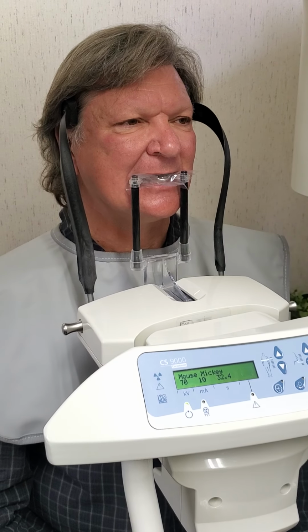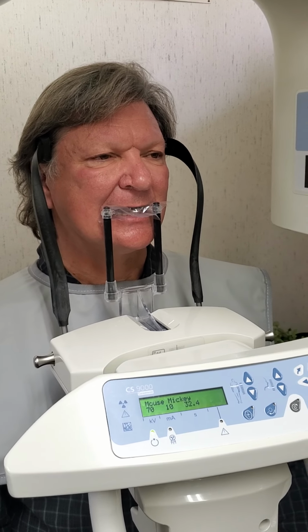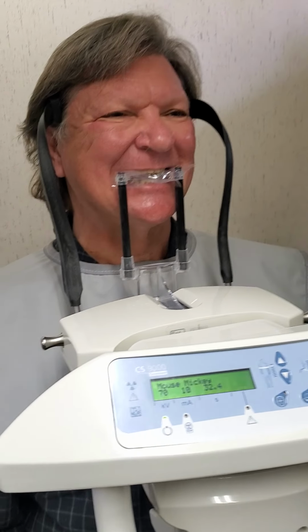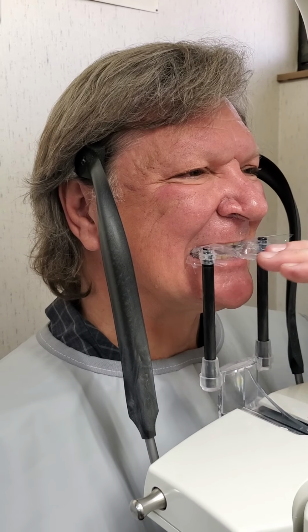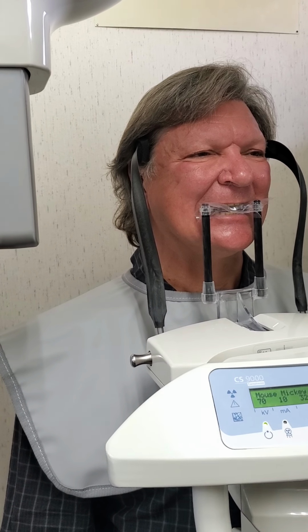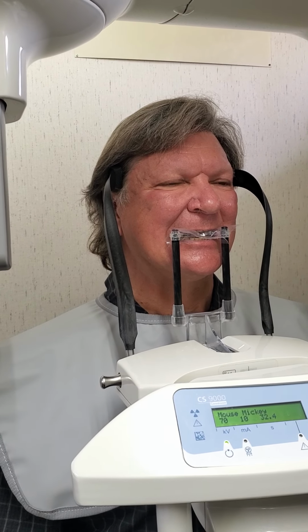So now, while they're biting on there, have your patient smile as wide as they can so we can see teeth. Go ahead and smile. Now you can see the occlusal plane of those top teeth is parallel to the floor. Right? So he's positioned on the machine correctly.